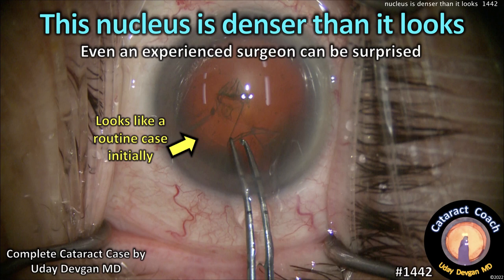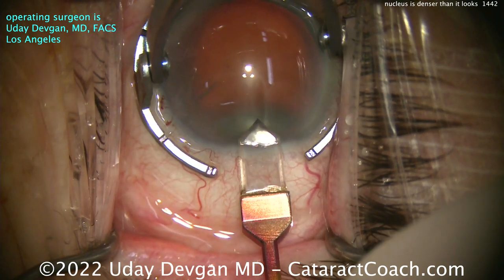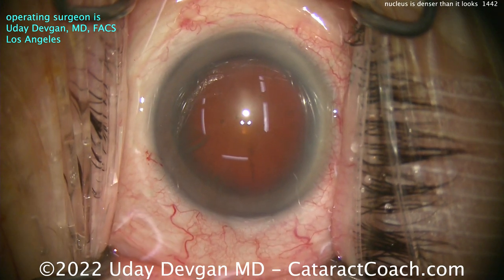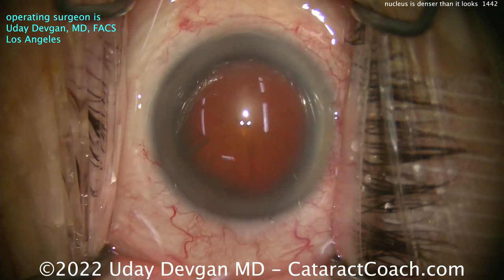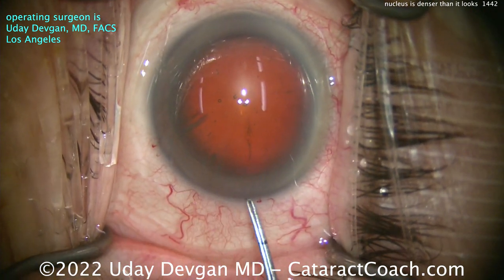This nucleus is denser than it looks, so even an experienced surgeon can sometimes be surprised. This is a case I'm doing. You can see using a diamond keratome to create that temporal incision, which looks pretty good. The red reflex is pretty reasonable, so I'm not anticipating this cataract to be all that dense. If you look at that red reflex, it's pretty clear.